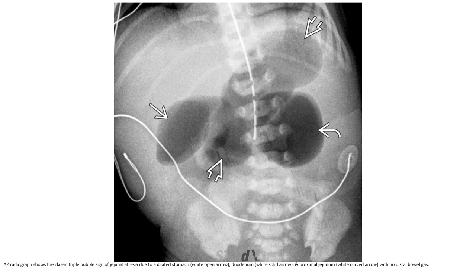AP radiographs show the classic double bubble sign of duodenal atresia due to a dilated stomach and proximal duodenum, with no distal bowel gas.